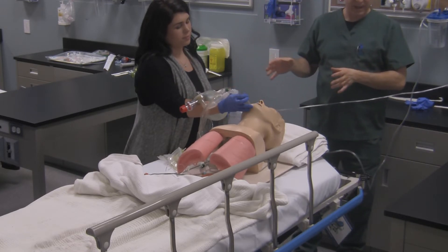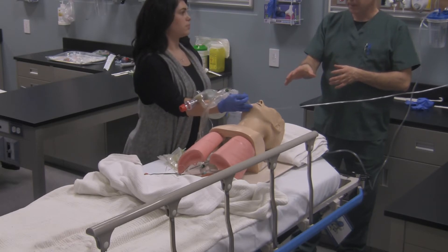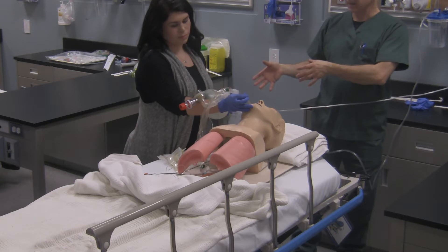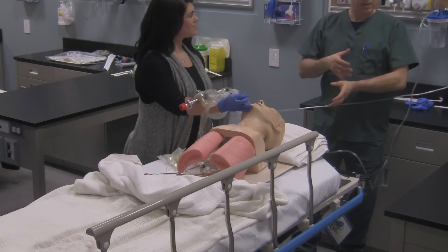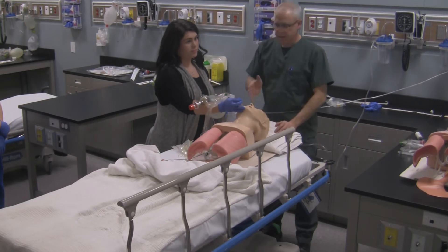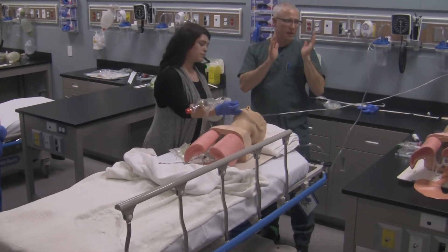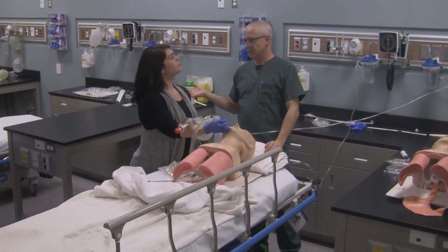The assistant has to be fairly talented because the tube cannot be left unsecured without taping, and the assistant also has to ventilate the patient. In order for me to do this tape job properly, there has to be coordination and communication between the person doing the intubation and the tape job and the person assisting. When you're going to tape the tube in place, take the tube and place it to one side of the mouth — whatever side it's on, that's the side you start the tape job.